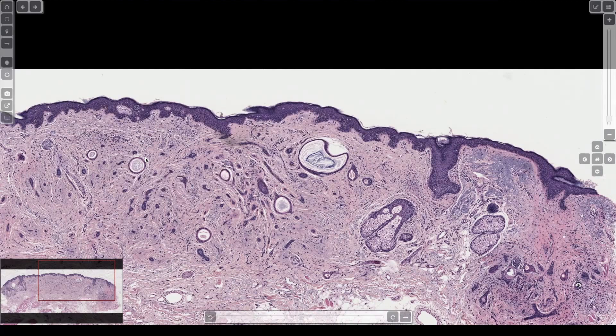MAC — microcystic adnexal carcinoma — is a locally aggressive carcinoma that is important not to miss. It's rare but it looks bland, not atypical, which makes it really hard to diagnose. It has ducts too, but they are usually located deep. For basal cell carcinoma, most of the time on a large enough sample you'll see some islands of classic BCC, or a little mucin, or a cleft — something that tips you off. I find BCC is usually the easiest to rule out.